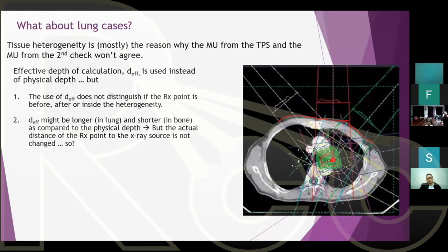So what you need to do is take the effective depth into account. Suppose the entire depth, if I measure it with a ruler, is 10 cm.